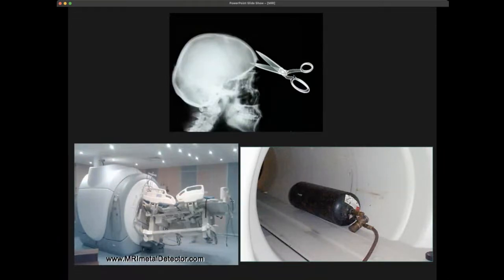And here you see even other examples. This is a real example of somebody who came in with scissors, and the scissors were thrown in and caused injury. You cannot bring a patient in a bed unless the bed is MRI compatible. Some people sometimes forget that also. Things like oxygen tanks can become really big bombs and be very unsafe. So this is actually the biggest safety problem. That's why in an MRI scanner room you always see signs at the doors: be careful what you bring in.